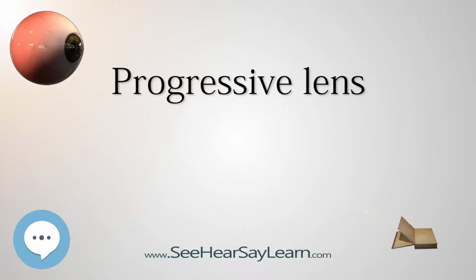The length of the progressive power gradient on the lens surface depends on the design of the lens, with a final addition power between 0.75 and 3.50 dioptres. The addition value prescribed depends on the level of presbyopia of the patient. In general, the older the patient, the higher the addition.